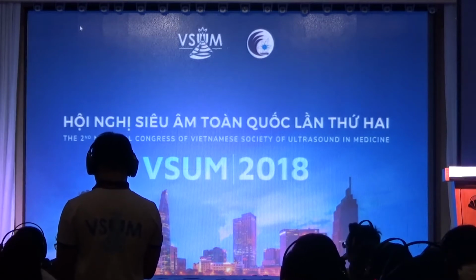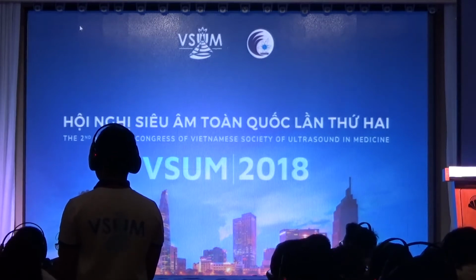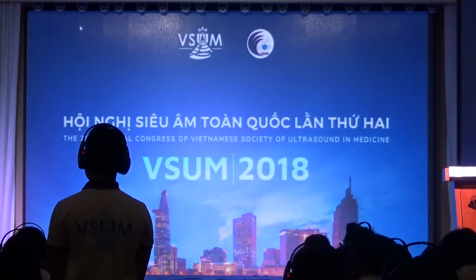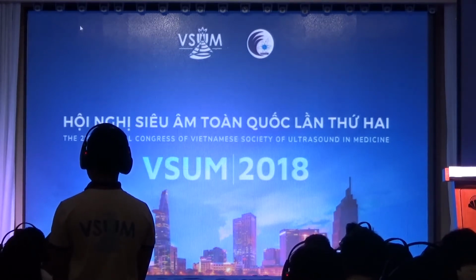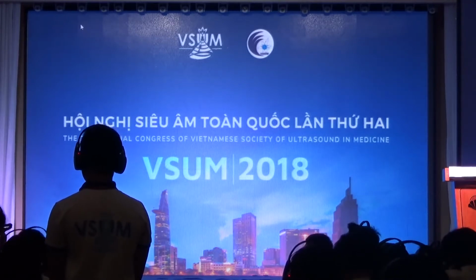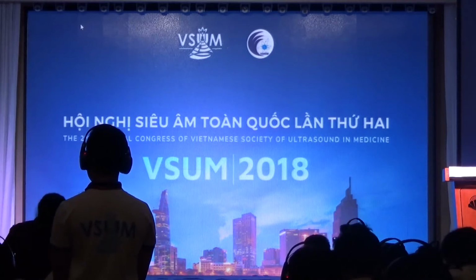And then there are many cutoff charts, so each vendor has their own, the WFUMB has their own, the EFSUMB has their own, SRU, the Society of Radiologists in Ultrasound, has their own. So it's kind of up to you and your institution which values you want to use.